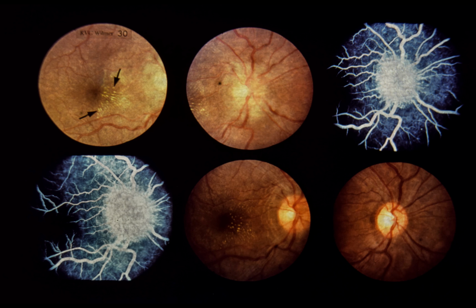Lower center. 2 weeks later, the right optic disc has minimal edema and normal color. The star figure in the nasal macula has partially resolved. Lower right. 8 months later, visual acuity in the right eye is 20/20. The optic disc and macula are both normal.